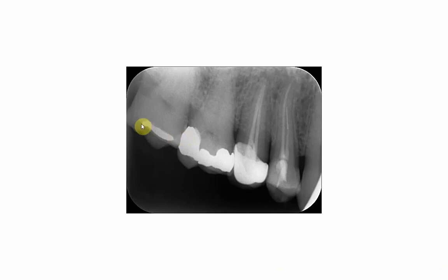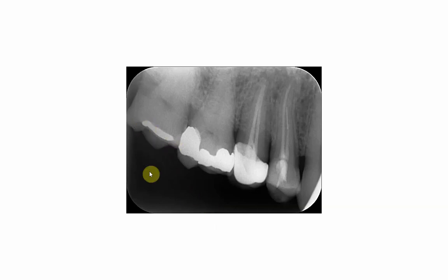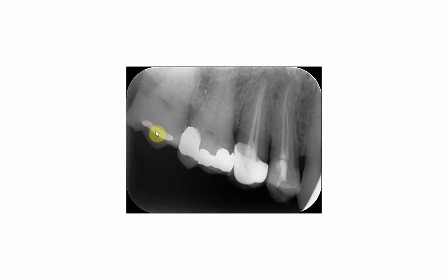On this tooth you will see that there is a class one composite filling. The composite filling, if you compare it to the other fillings or restorative materials which are closer to it, appears less radio-opaque than the other metallic restorations. This is the class one composite restoration.